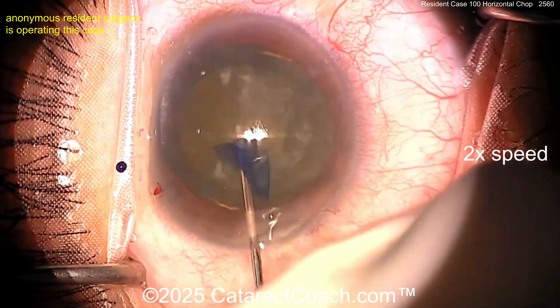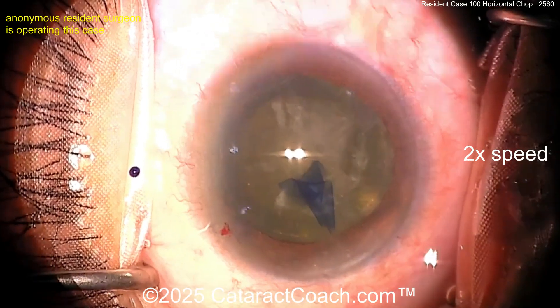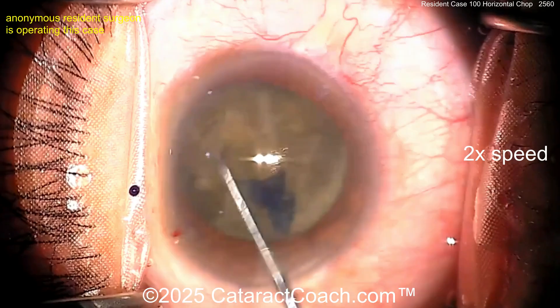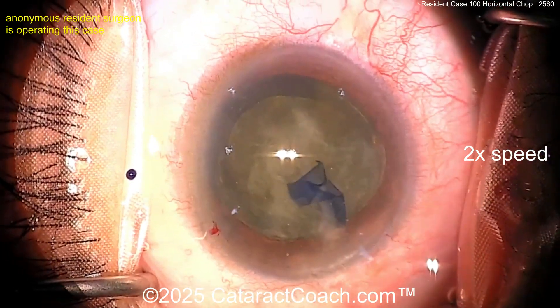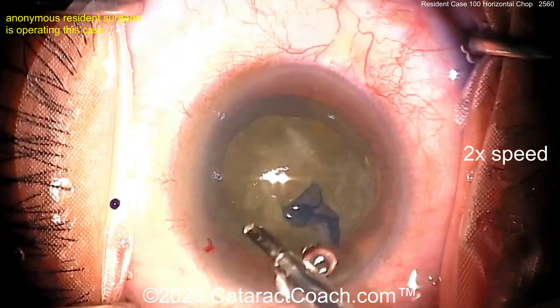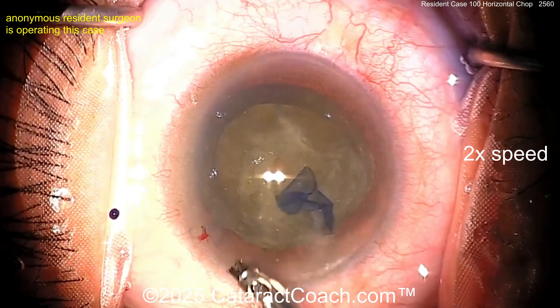Let's see some hydrodissection here — a little rotation, maybe a little more hydrodissection. I like to see it spin. If it does not spin, you will not win, especially if you want to do chop techniques. There's the rotation — look at that Rosatelli spin! You have definitely been watching great videos online, including Niceta Rosatelli. That's his technique; I love it.